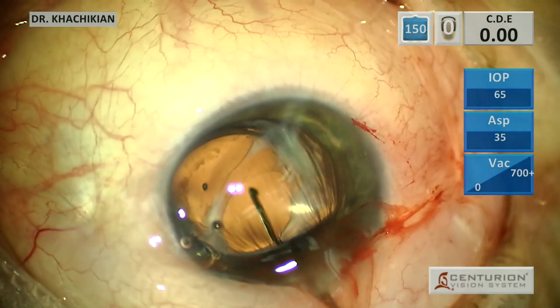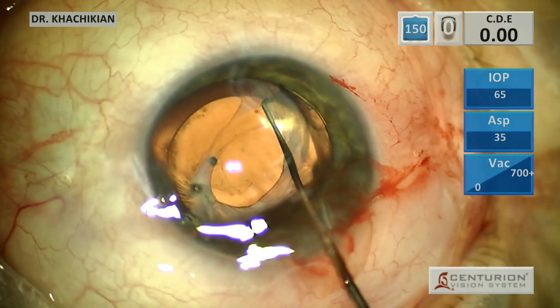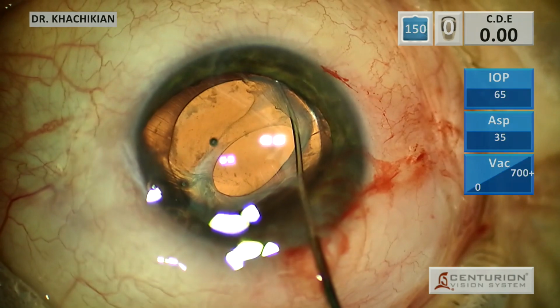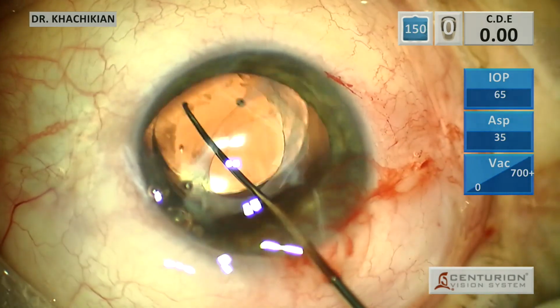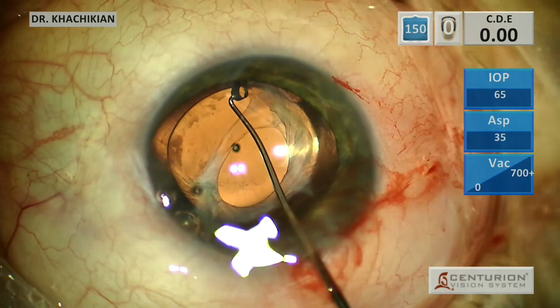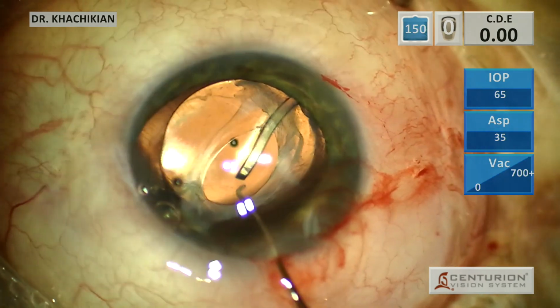Now you can see this capsular tension ring went in, but it did because the lens is already in the bag, which is usually not how we would place these. The capsular tension ring and the haptic are a little bit tied up in the periphery there, so we've got to address that because we don't want the capsular tension ring intertwined with the haptic. It looks like an Alcon lens, so we'll work on getting that haptic out of the way of the capsular tension ring.